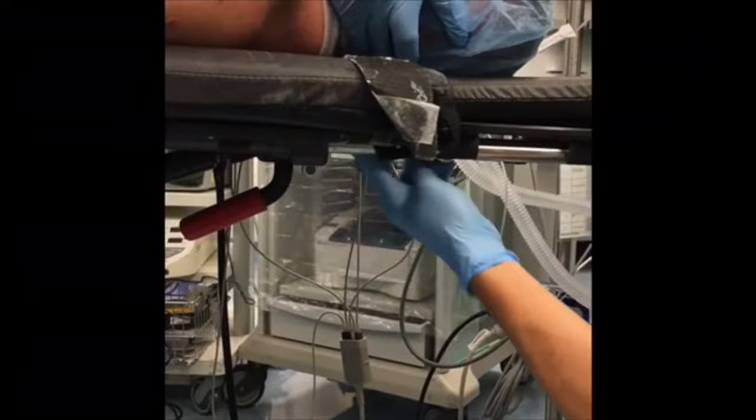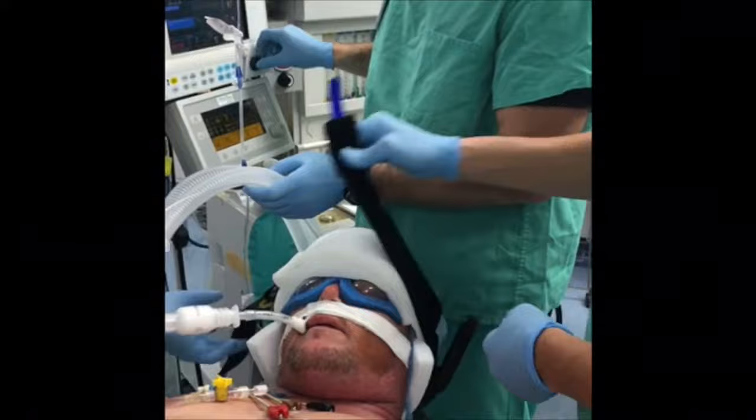Following this, the head, neck, and torso are supported in a neutral position to prevent cervical stress. Care is taken to assure the head positioner is locked and that anesthesia is comfortable with this positioning. Padding is then applied across the forehead before tightening the head positioner.